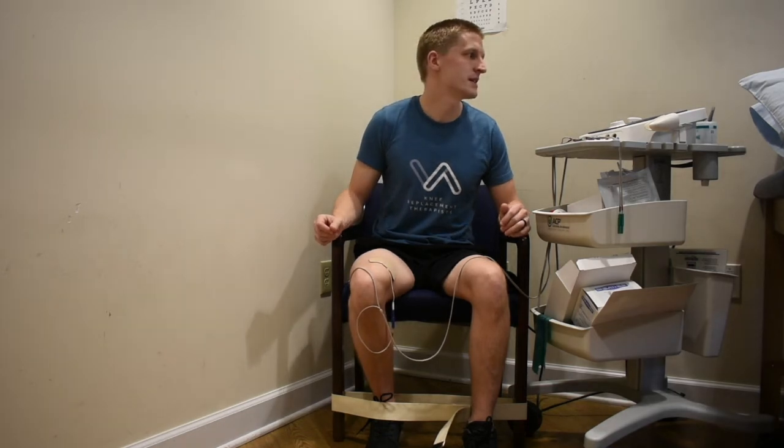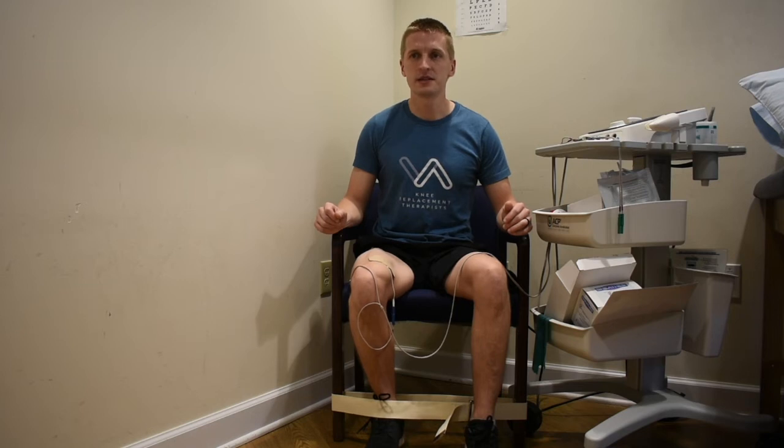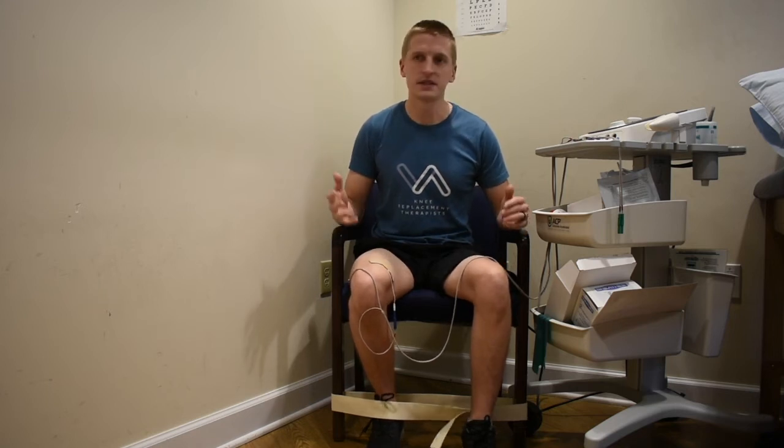You'll hear a beep sound indicating the stimulation is about to start. As you feel that input, actively try to contract those quadricep muscles — push, push, push for 10 seconds, then relax. This will repeat for either 10 or 15 contractions depending on the duration you've set. This is a great way to start increasing your quadricep muscle strength after surgery.